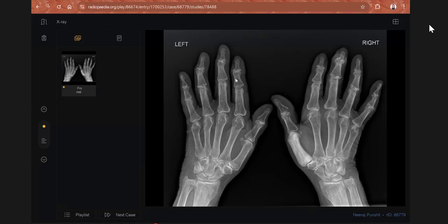Sir, if you're considering just a thumb, or you're talking in general? I'm focusing on this thumb. Looking at the sclerosis and expansion, I can think of solitary spina ventosa, but it also gives more of a lucent appearance. Apart from that, this sausage digit can also be seen in a single sclerotic met in the hands. It can be other sclerotic lesions, so less likely fibrous dysplasia.